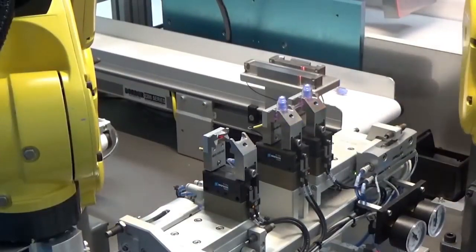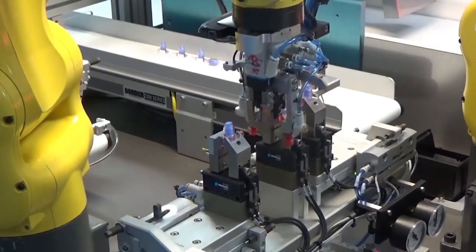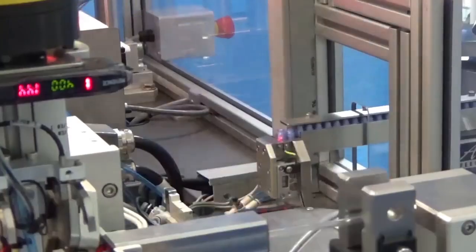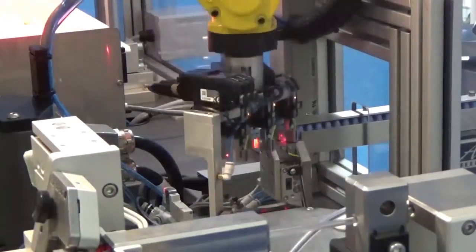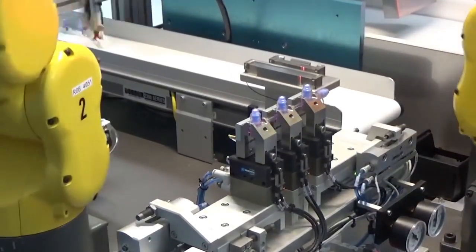As the tubing is highly pliable, guide grippers located on the end of arm of the robot assist in partially inserting the wetted tubing into the valve before opening and clearing themselves, and before the final insertion depth is achieved.